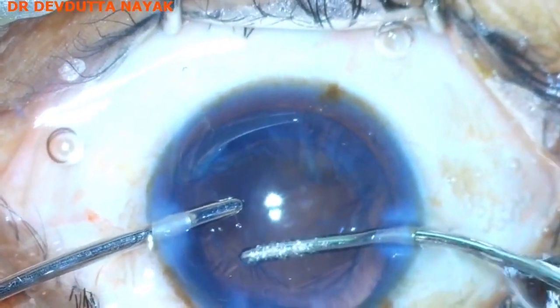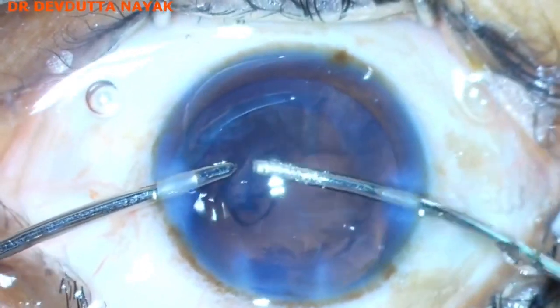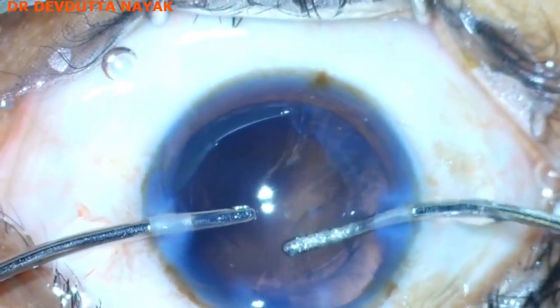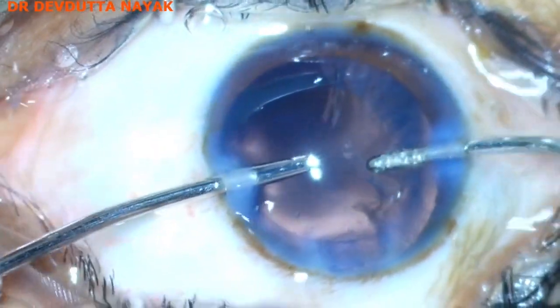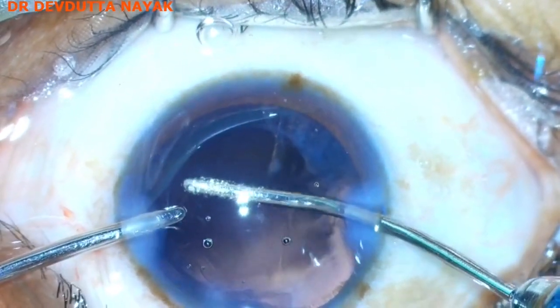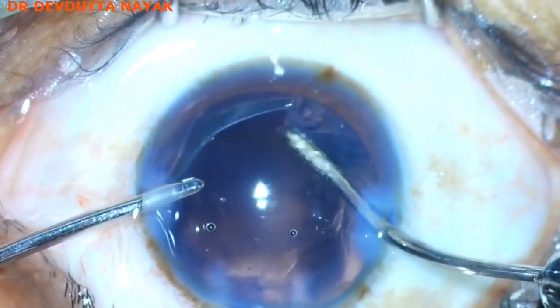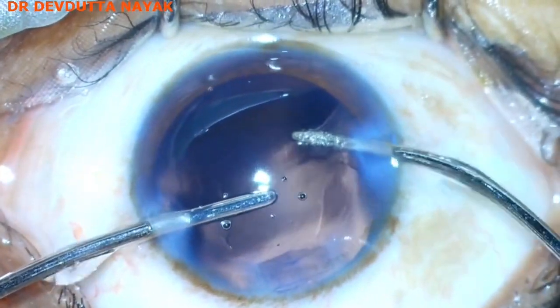Manual irrigation-aspiration is done to remove the cortical remnants. Thorough clean-up of the capsular bag is very important as it prevents posterior capsular opacification.